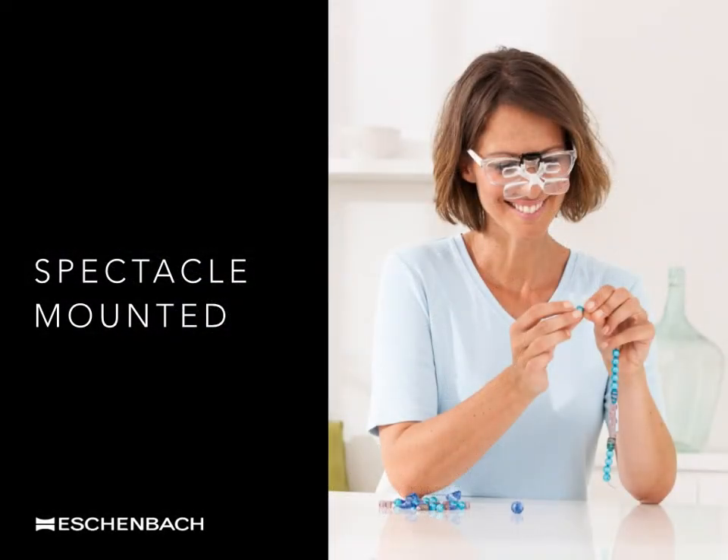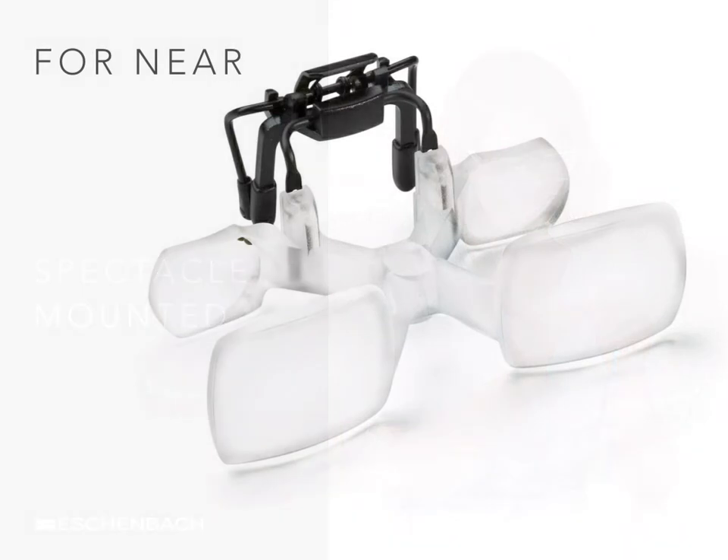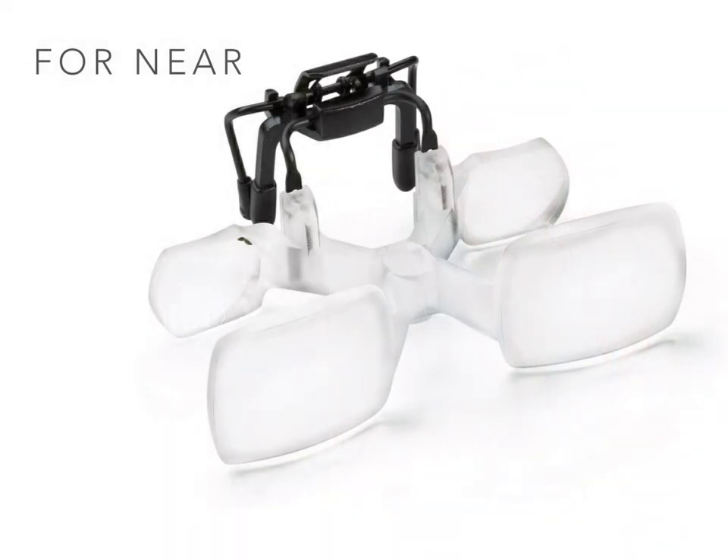For those individuals who need or prefer to continue wearing their own spectacle prescription, a similar telescopic design is available for clipping onto the front of the user's glasses. The greatest benefit of any near-viewing telescopic system such as this one is the natural reading posture provided by the 35 cm working distance. The overall weight should not be so heavy as to cause discomfort or pull the spectacles away from the face.